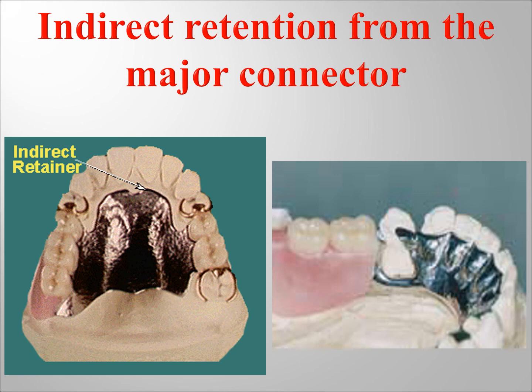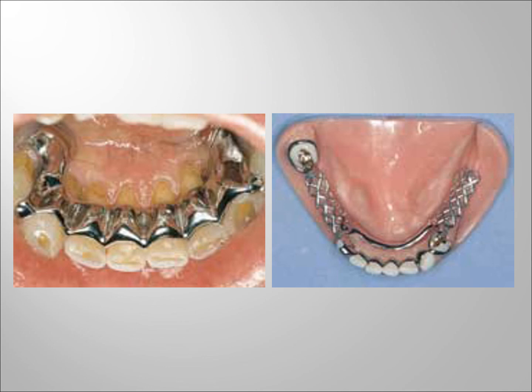It is more favorable if it is horizontal. And these two, the dental bar major connector and the open Kennedy major connector, also provide indirect retention for the prosthesis.